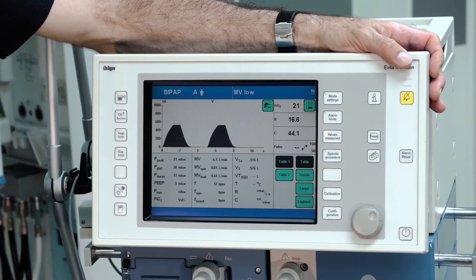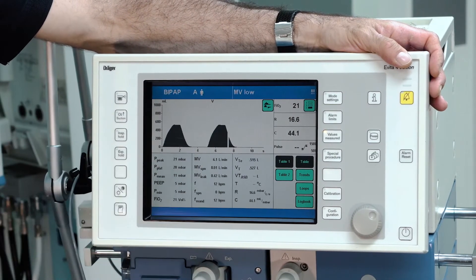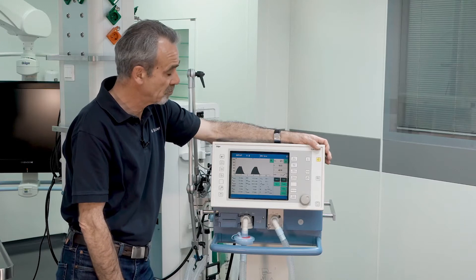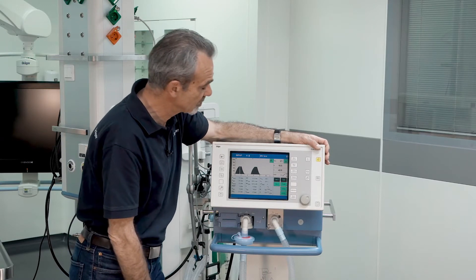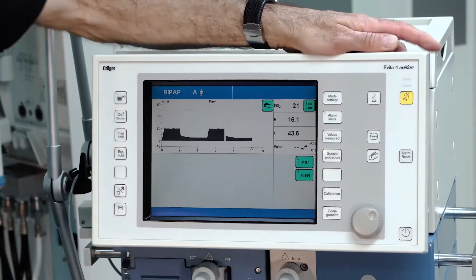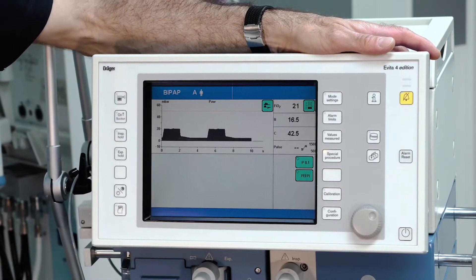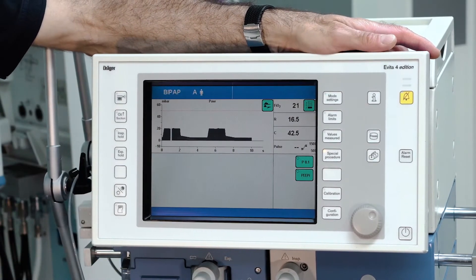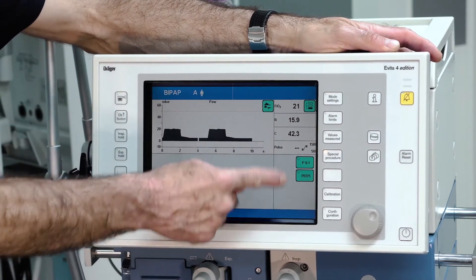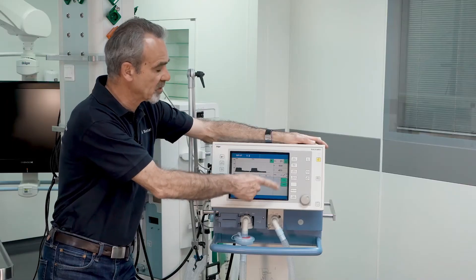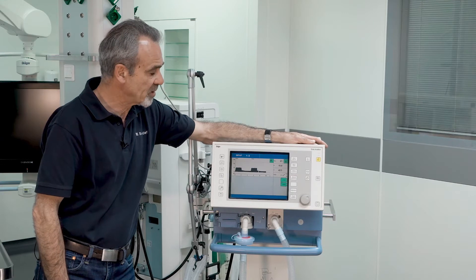Measured values delivers two tables with all available measured values at a glance. Push the button for special procedures and the menu for available special procedures opens. In this example, you have the possibility to measure your P0.1 and your intrinsic PEEP value.